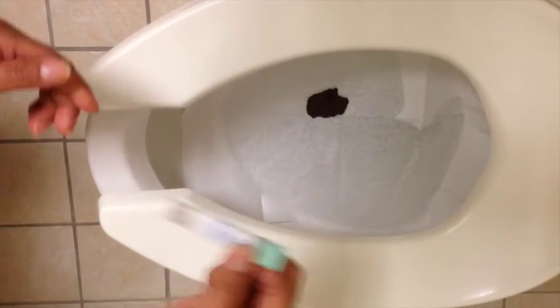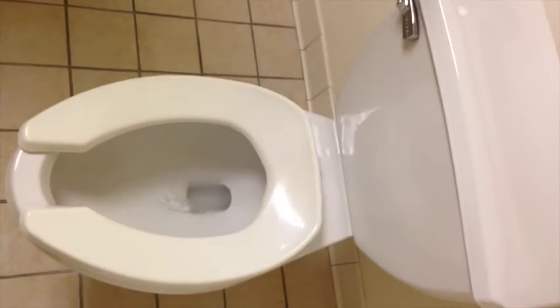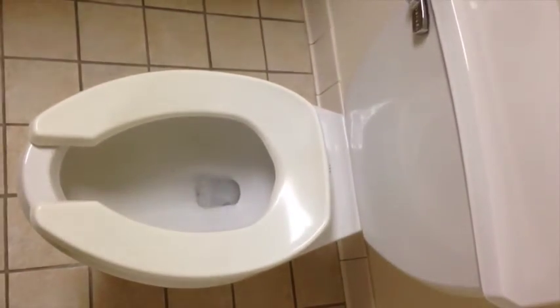Do not reopen. Flush. Collection paper is biodegradable and will not harm septic systems.